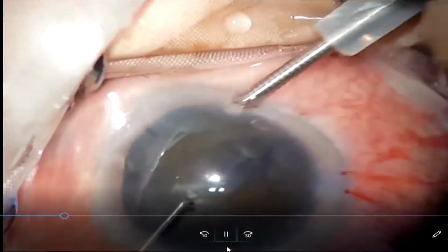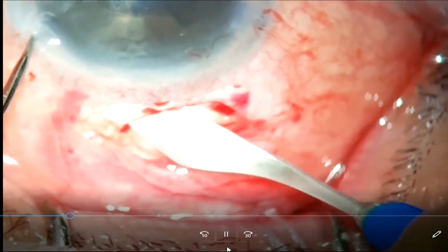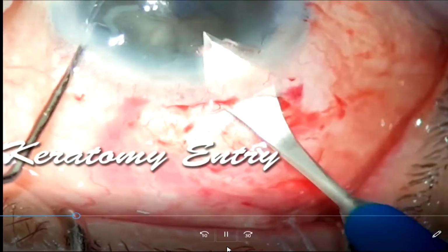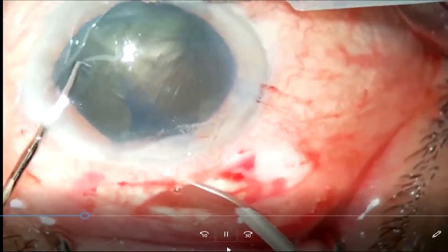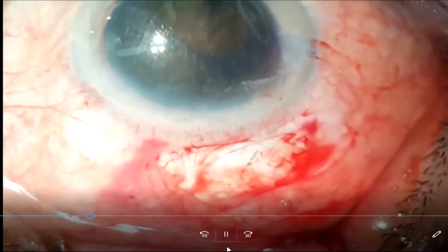Now, this is the anterior chamber maintainer. We hold it very close and fix it. Now see, the side port is used to stabilize the globe, and you always cut with the keratome in a forward direction. It is important to dissect laterally because this is where the nucleus is going to engage.